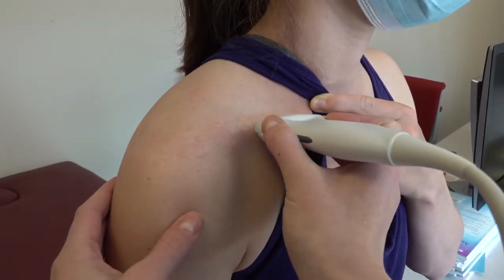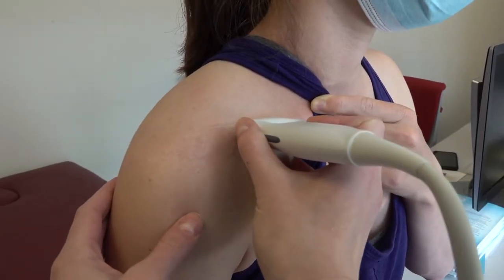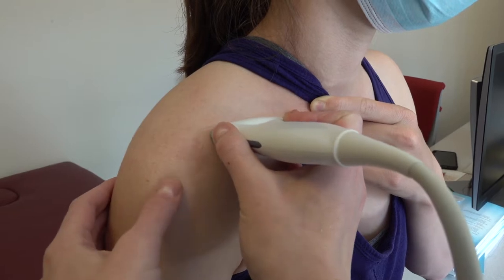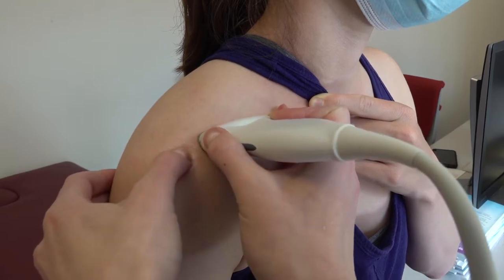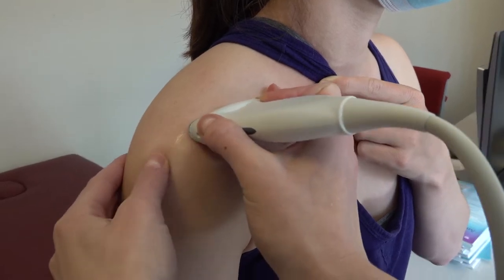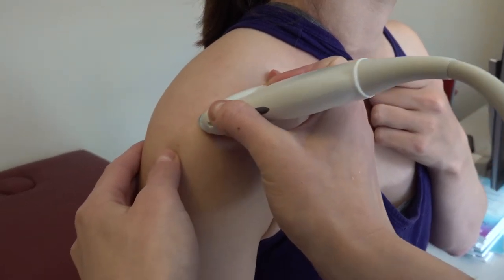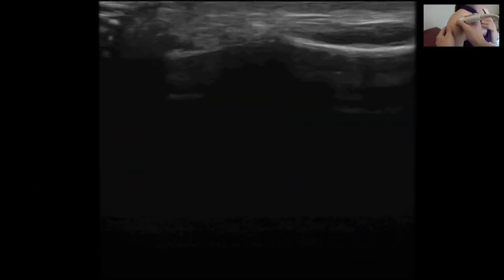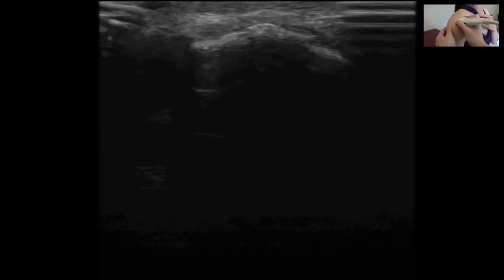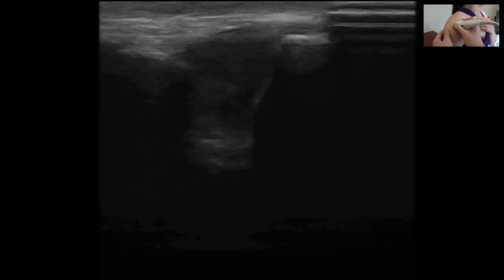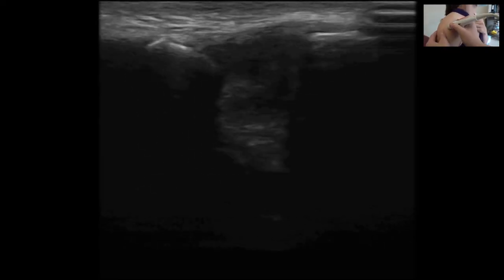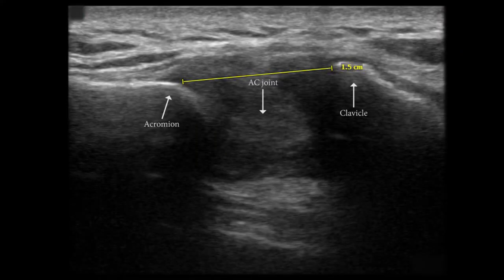Alternatively, place the probe with the marker facing the patient's right at the level of the clavicle, and follow the clavicle laterally until the AC joint is seen. Pathologies such as traumatic AC joint separation may be visualized.